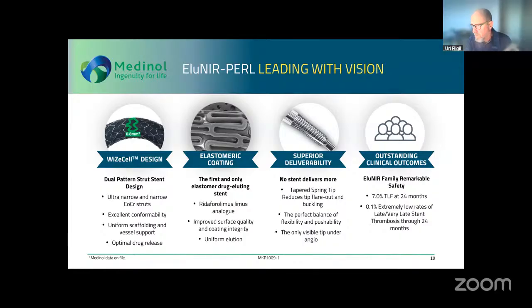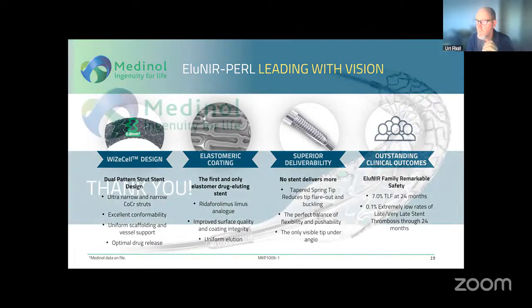In terms of the outcomes of the clinical trials, we present 7% TLF at 24 months and 0.1% extremely low rates of late and very late stent thrombosis at 24 months. With that, I would like to thank you very much for your time.